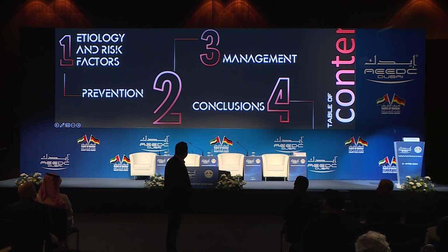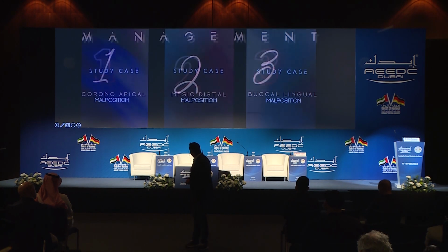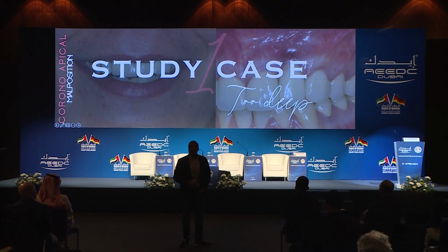So this is really important, to have all these on board before you place your implant: bone, soft tissue, implant placement, prosthesis. Four pillars for aesthetic implant dentistry. Now, if you have these complications, can you manage them? And what can we do with these cases? So I'll share with you some of these cases. Most of them were treated more than 10 years ago, so you have a long-term follow-up to see what happened to these cases.